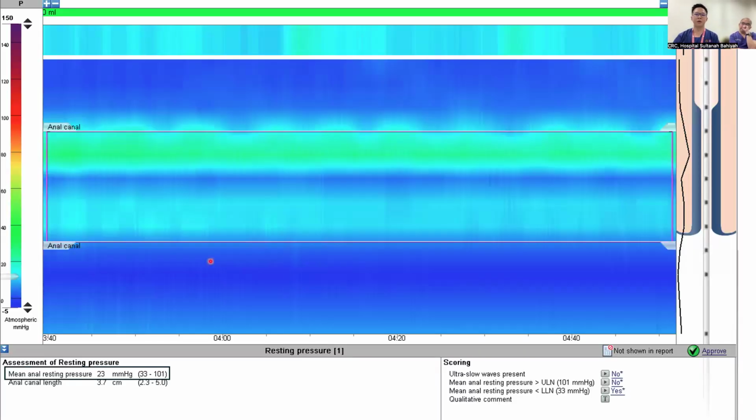Doesn't close very, very well. So this is a patient, an elderly lady, an 80 years old lady who is having a lot of diarrhea, who is having to rush to the toilet, cannot hold it in. What you see over here, you see two very distinct waveforms.